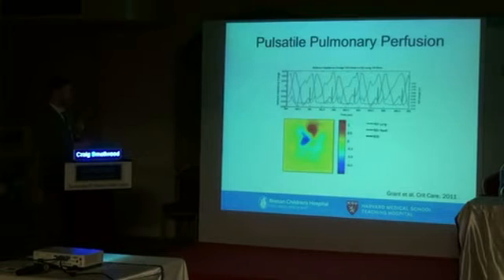So differences in impedance when you're breathing. And then also the heart is right here. We know that anatomically. But then you can see the differences in pulsatile perfusion. And what they did was they plotted this over time. So you can see an ECG in black here. P, QRS complex, another one, and then look at the differences in impedance from the lung and from the heart. It's honestly not as mature as the ventilation mapping, but the hope is that this type of methodology could be applied simultaneously, so that when we look at distribution fields of ventilation, we could also look at a map of perfusion and hopefully titrate our ventilation such that those 2 areas match, and that would be the best thing that we could target.